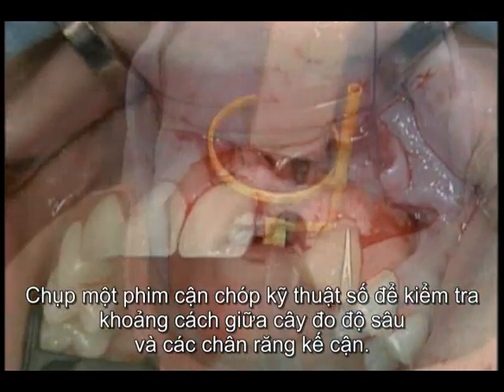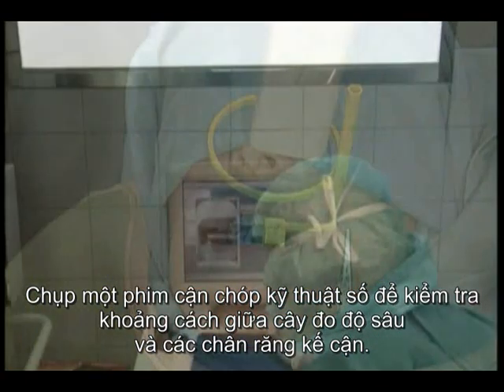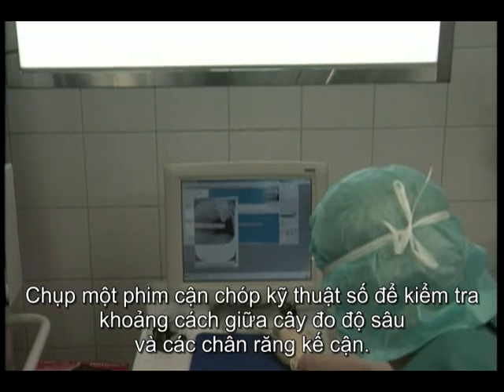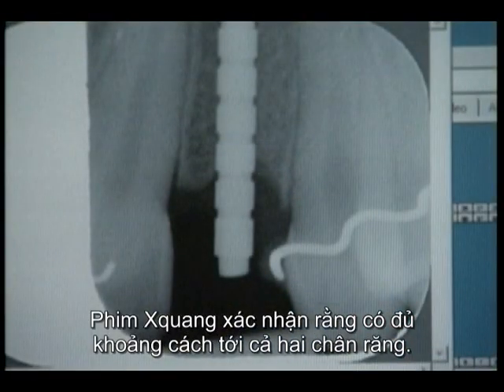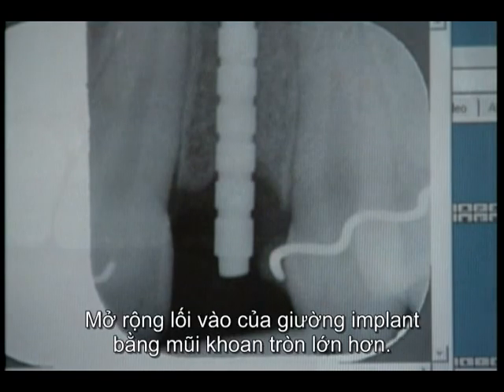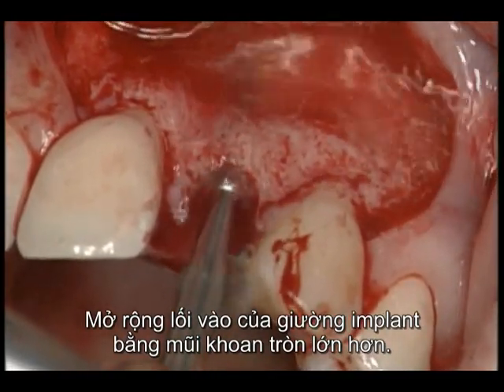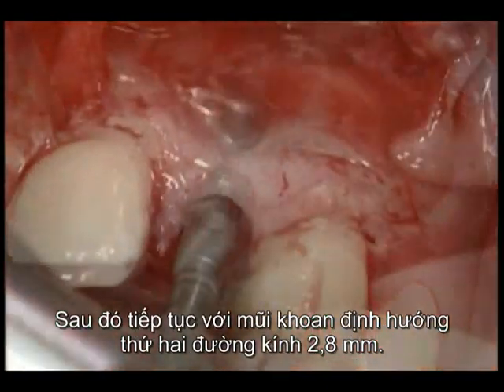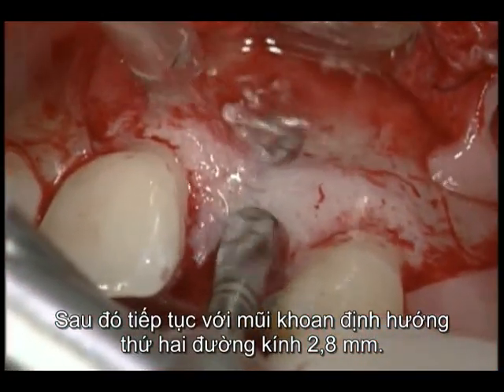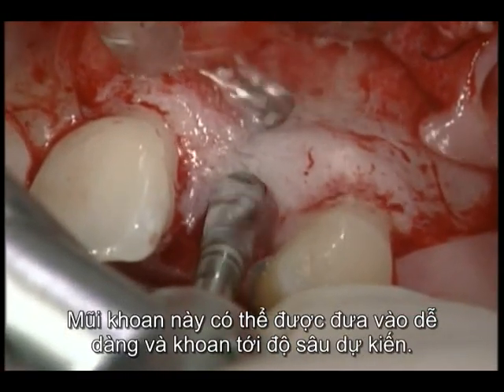A periapical digital radiograph is made to check the distance between the depth gauge and the adjacent roots. The radiograph confirms that there is sufficient space to both roots. The access to the prepared implant bed is expanded with a larger round burr. Then comes the second pilot drill, which is 2.8 millimeters in diameter. It can be easily inserted and prepared to depth.